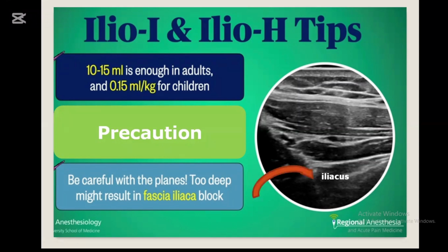Now, if you look here, there is the iliacus muscle that is covered by fascia iliaca. So if your needle comes too deep and pierces the iliacus muscle and you deposit your drug here, it may of course lead to fascia iliaca block.